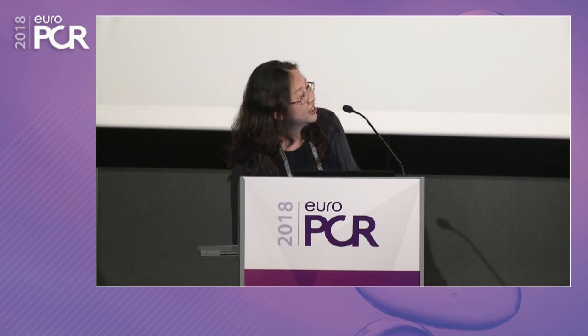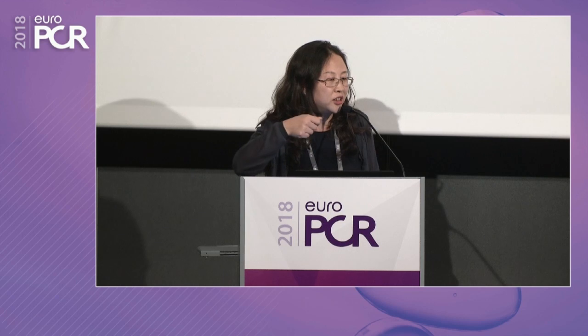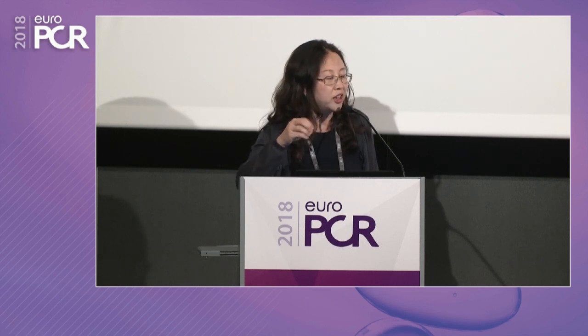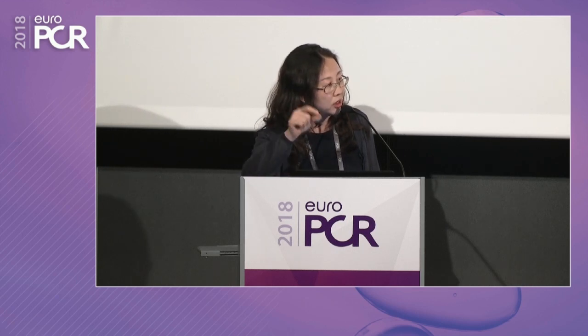I have one technical question. Maybe I didn't see well, but I have the impression that you didn't pull the wire out from the circ when you did crushing of the stent protruding from the circ. Was it intentional or did you just forget to remove the wire from the circ when you crushed with the balloon? I know what you mean. It's intentional because I did a very mini crush. So I didn't pull the wire out of the circ stent for very long.